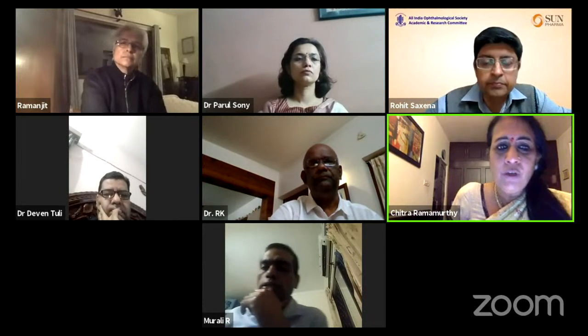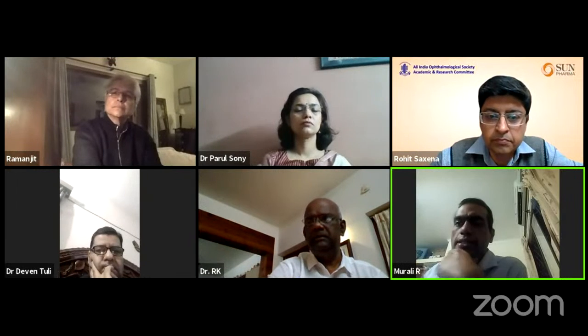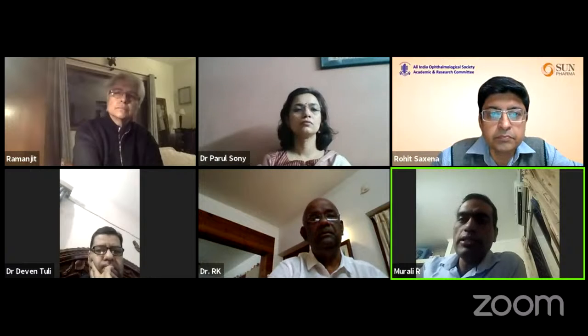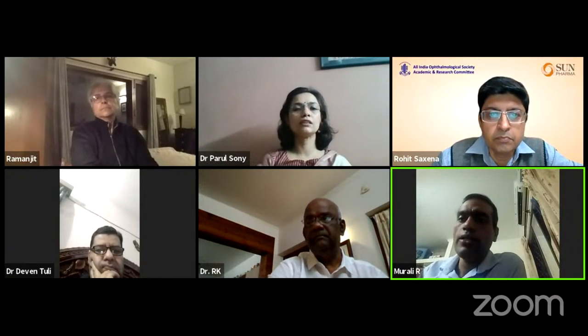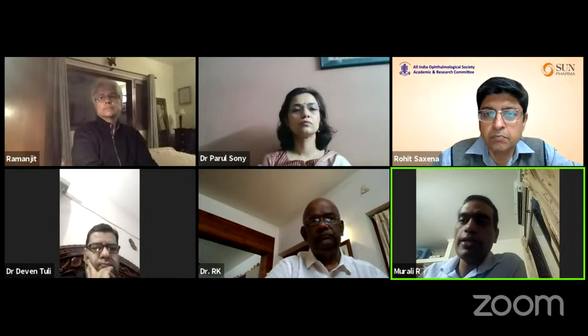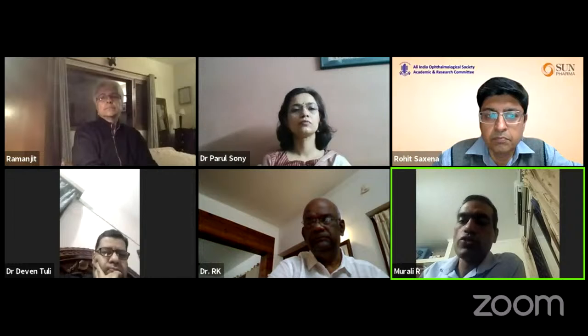Murli, do you have any other question to ask before we move on to this very important topic? I have a question for Dr. Parul. In moderate and severe glaucoma, how frequently would you be repeating the fields? I mean, like once every 3 months or once every 2 months? And the glaucoma progression analysis doesn't give you a progression for the macular and 10-2 fields. So how would you assess progression on macular and 10-2 fields?